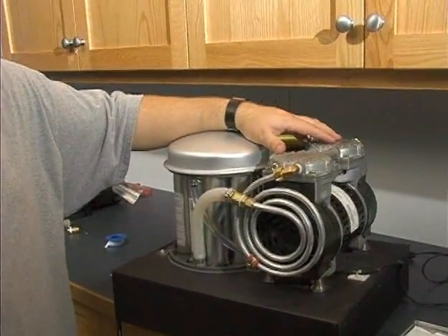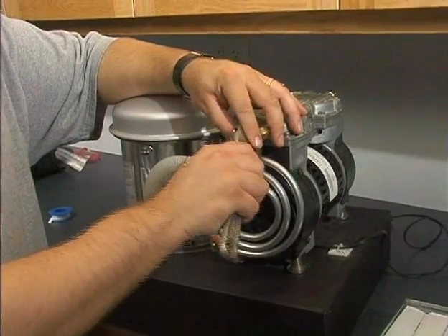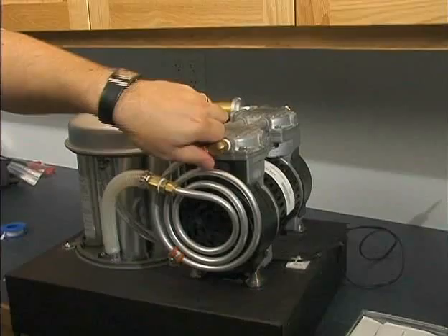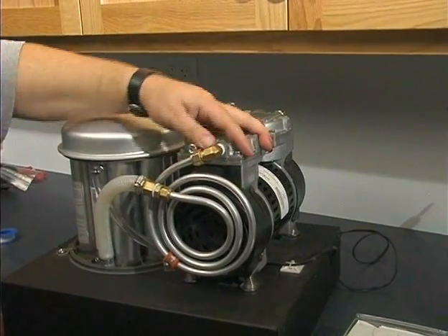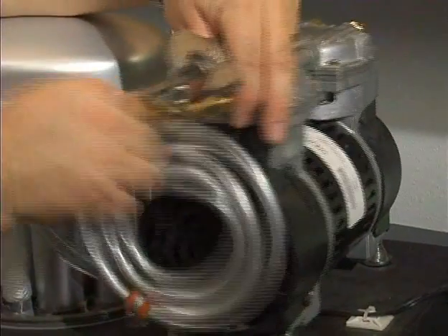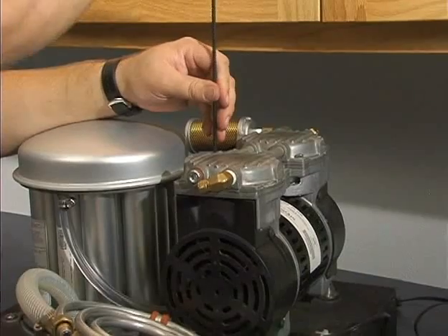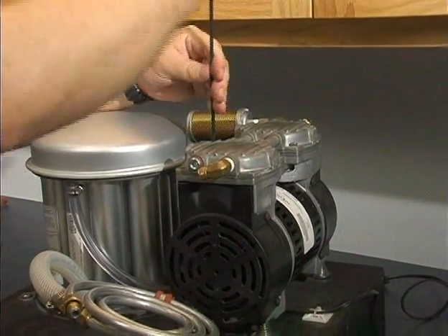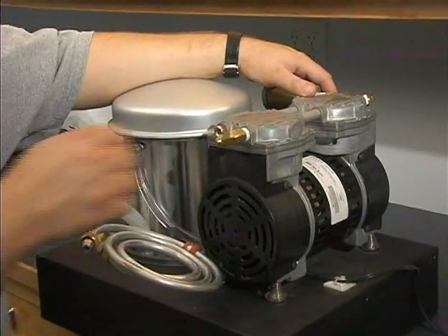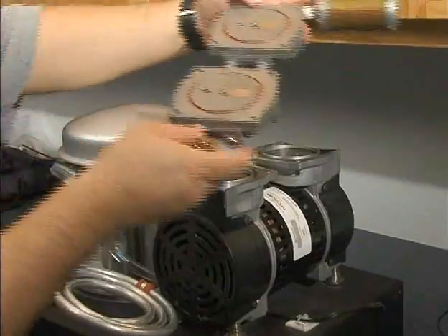Now we're going to go ahead and rebuild the compressor. We'll start by gaining access to it and loosening up the output fitting. After the output fitting has been removed, we'll remove the four screws from each head of the compressor. After the screws are removed, we'll simply lift up the plates and set them aside for a moment.